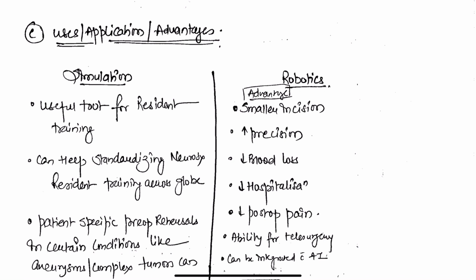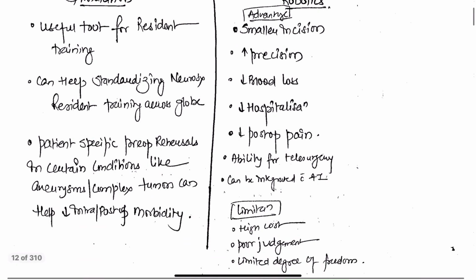And also in a specific condition where the tumor is difficult to treat, then we can use this system so that particular people are trained in a particular way, and we can also rehearse it. It reduces intra-op time, reduces intra-op blood loss, and reduces post-op morbidity and mortality.